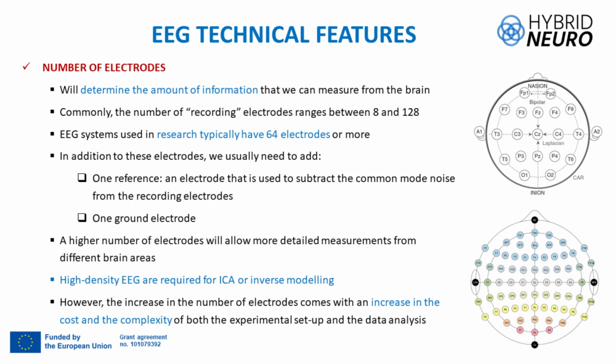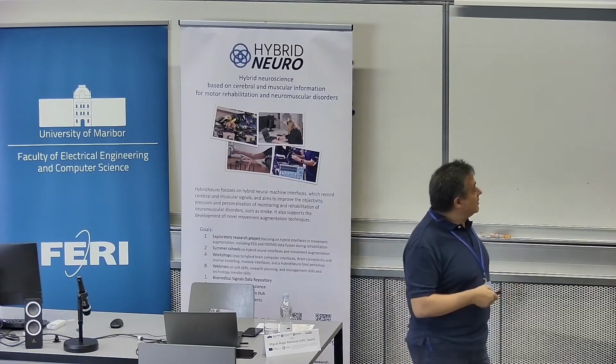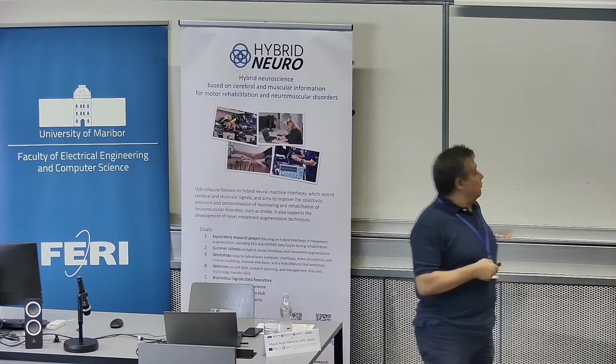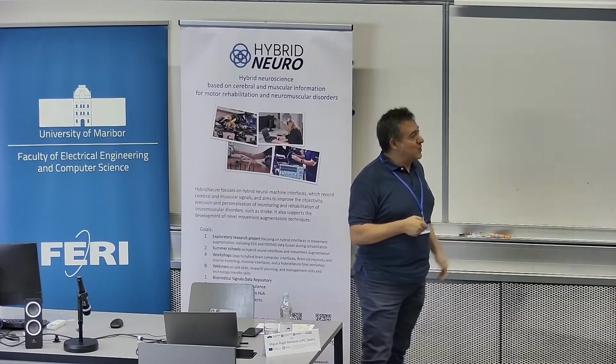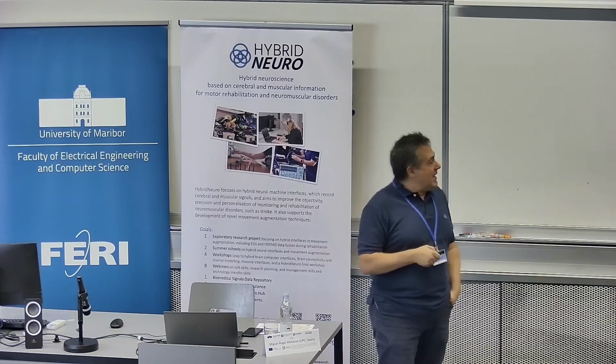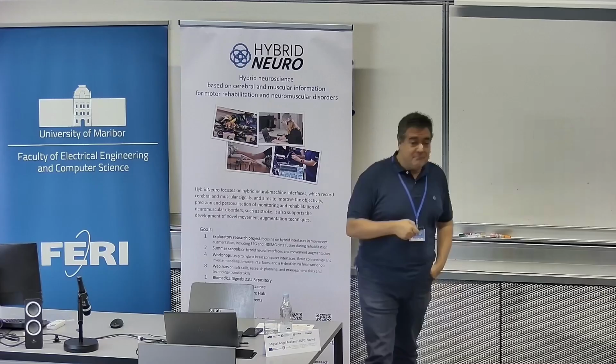But thanks to the improvement of the technology and the cost, now we can record many more channels, up to 128 or even more. Maybe you can consider that if it's possible to have more electrodes, it's much better. Well, theoretically, for sure, although it's more expensive. But there is more redundant information in the electrodes if you have a lot of them.